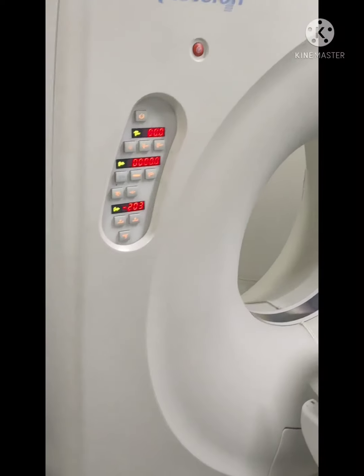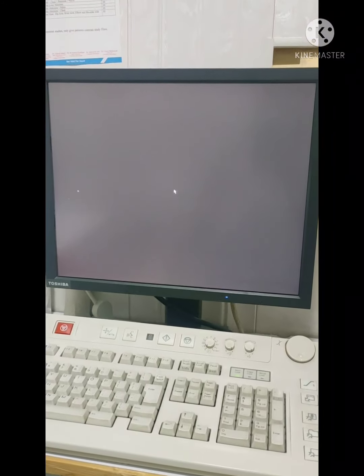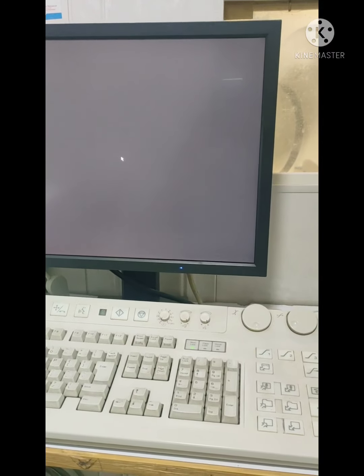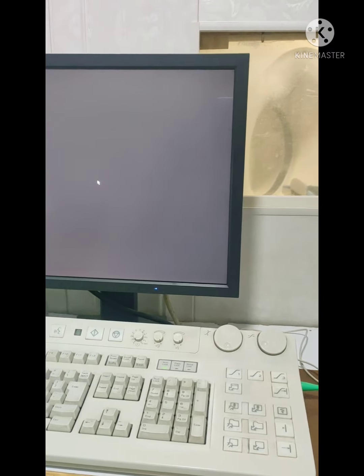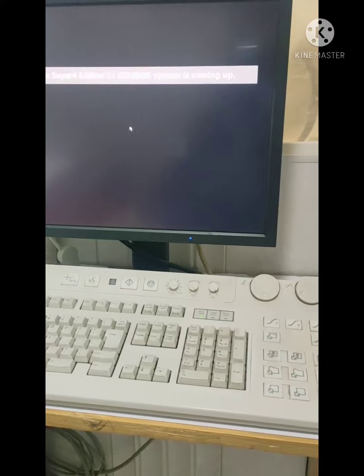The system is getting ready. The system is getting on. There are delays between this — getting ready to get any recommendations related.